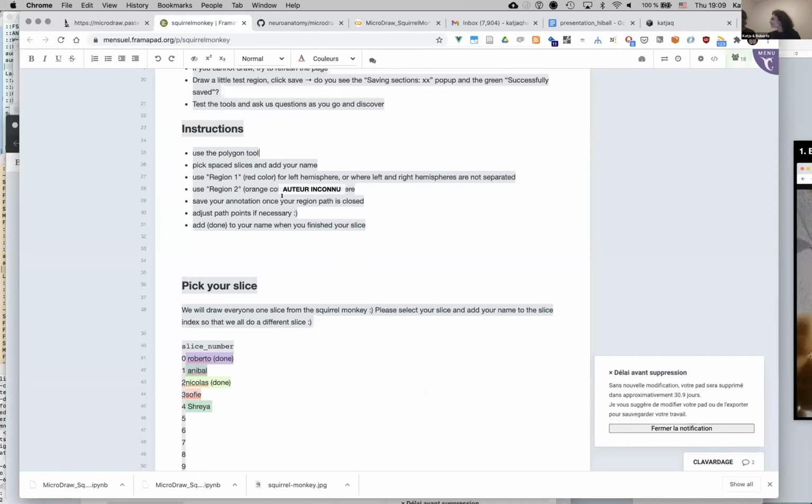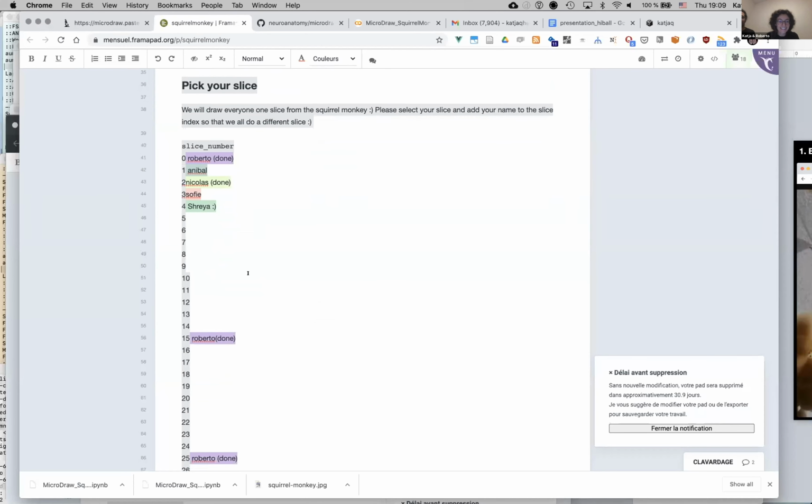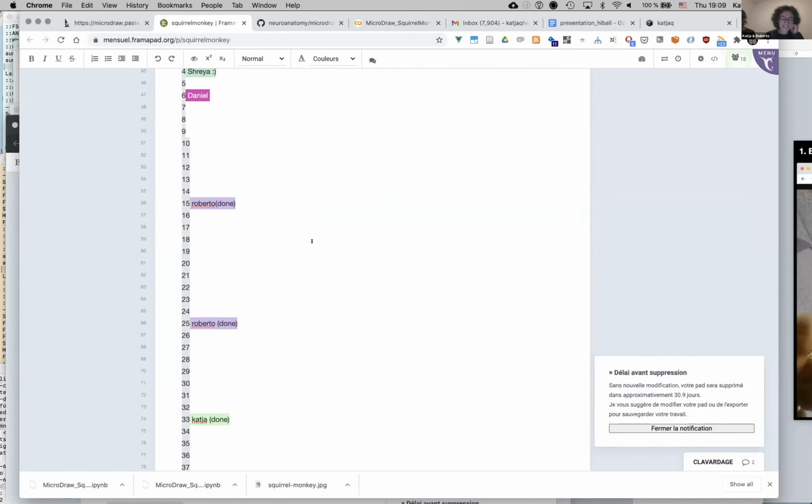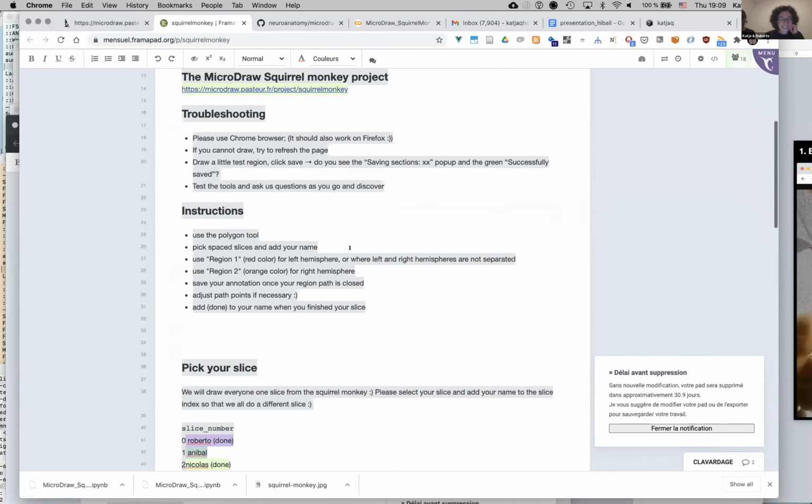Please put your name in a slice. We are all going to work here. Yes. I only see Shreya writing her name, but we need all the names. Yes, everybody who is here. There you go. And don't be shy. There's nothing you can do wrong. There's an undo button. Daniel. There's refresh page. There's save button. And I see Daniel. And so we get the whole brain done all together.